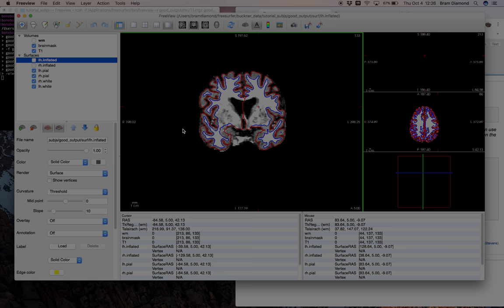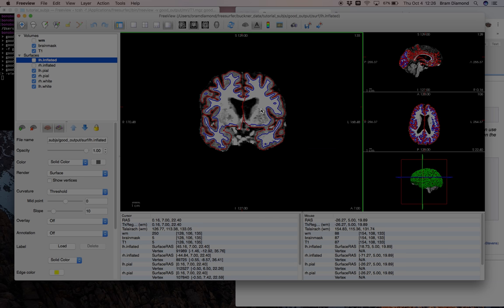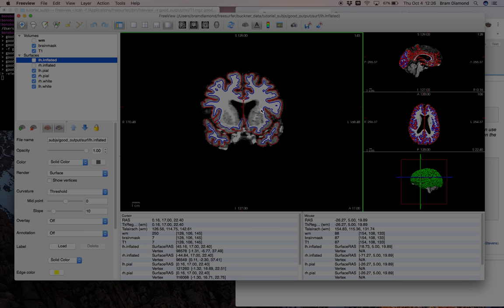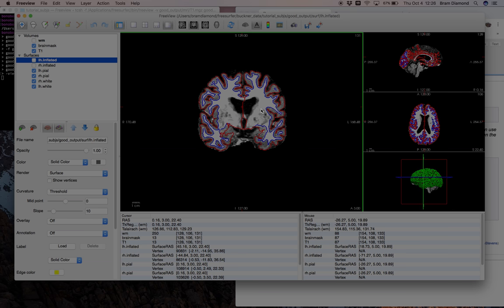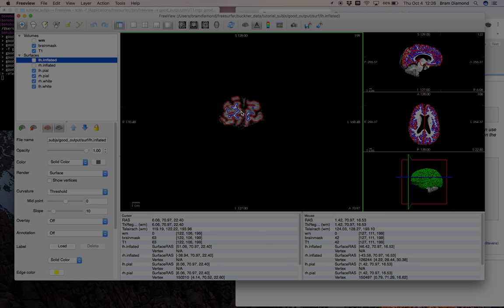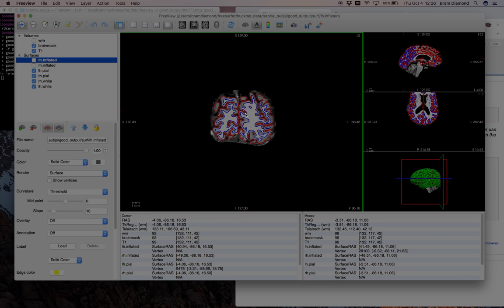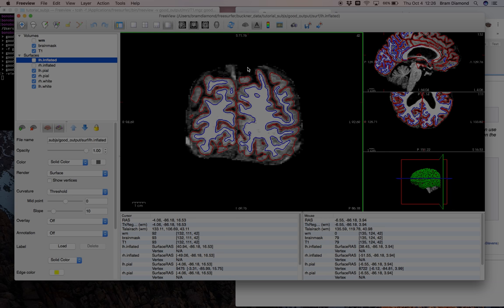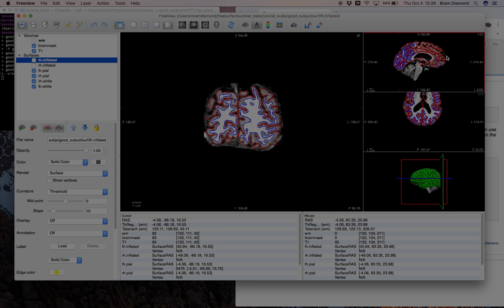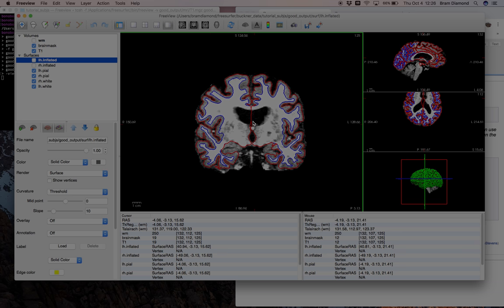In the main viewport, you can scroll through a volume using the up and down arrows or page up and down. I'll go anterior in the brain by pressing the up arrow, and posterior by pressing the down arrow. You can also use other orientations to quickly jump through the brain by clicking in the smaller views. You can zoom in using the scroll wheel, or right-click and drag up and down for a smooth zoom. You can also pan around an image by clicking down the middle wheel and dragging.